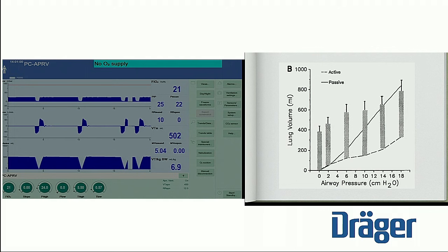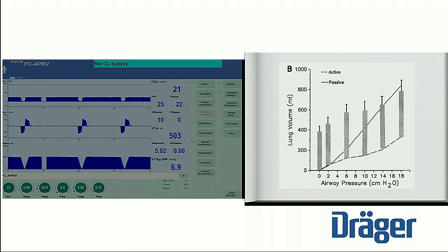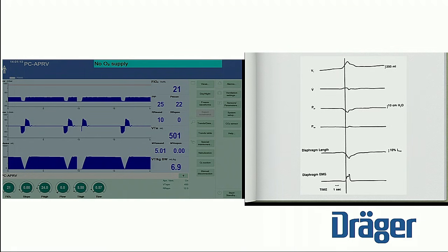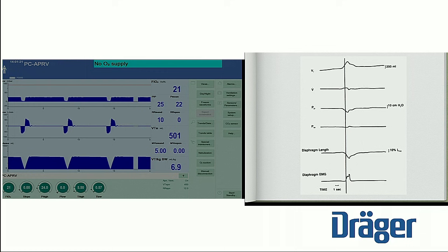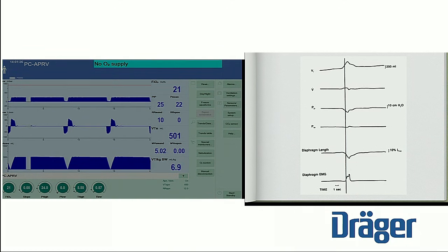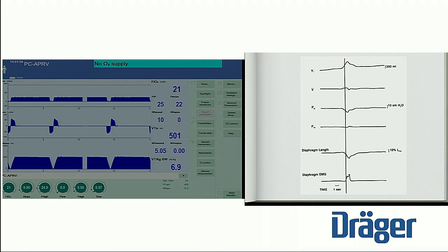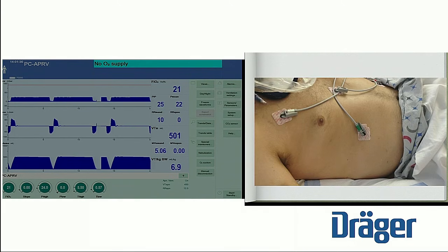As you look at the diaphragmatic change — this is change in pressure — you can see that as you inflate the lung volume, the active portion of diaphragmatic contraction goes down, but you still maintain total. You can see here this is passive and this is active. The lung volume is actually created by more passive expansion of the chest rather than active expansion. Here's the diaphragm EMG signal — this line denotes when the actual EMG fires. Well before that, you have a tidal volume, flow of gas, and a pressure drop in the airway, occurring before the diaphragm actually contracts.